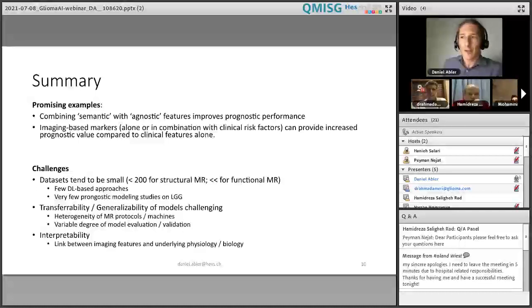Finally, a big role here is what the talk of Michael Bach just touched upon, the need for standardization. But not only standardization with regard to anatomical imaging and to have similar appearance of edges, for example. If we talk about those radiomic features, we would also need to have phantoms for texture features, for example, for MR texture features.